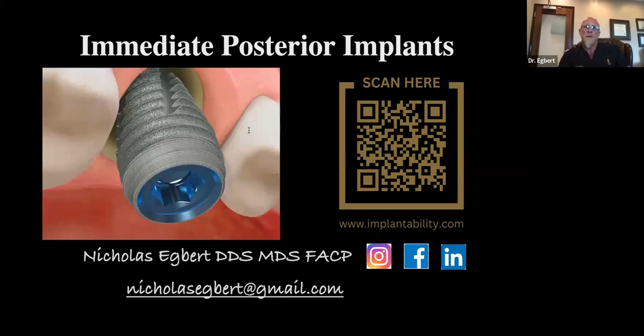Here's the next question. Another good question is, how do you place membranes when you do immediate implant with bone graft and temporary crowns? That's a loaded question. When we do membranes and temporary crowns, that's typically going to be in the aesthetic zone. We do have an aesthetic zone course online and hands-on, but you have a myriad of options. It depends on how much facial plate you have left. That's been well documented in the literature.